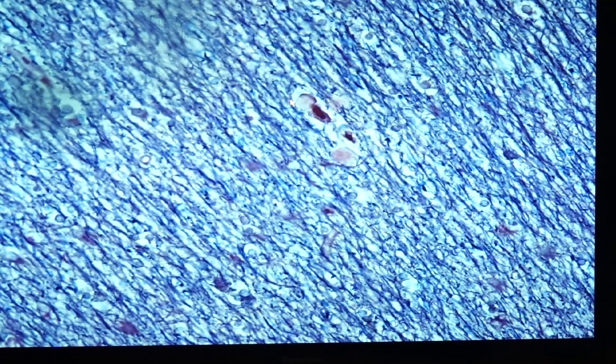On the slide, you can see the spheroid structures colored pink — very easy to identify. To view them differently, you use Congo red stain. You can see the round or nodular appearance. Using the Congo red stain under a polarizing microscope, they will show apple-green birefringence.